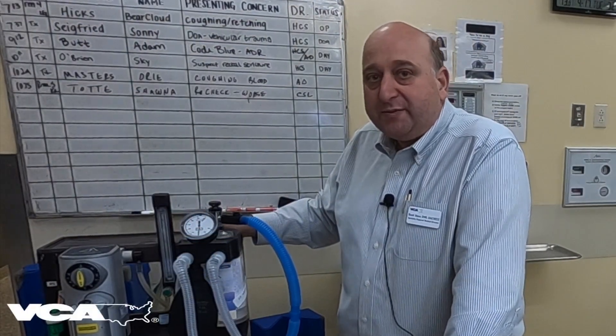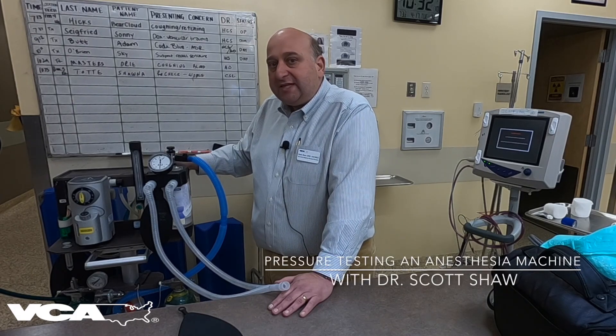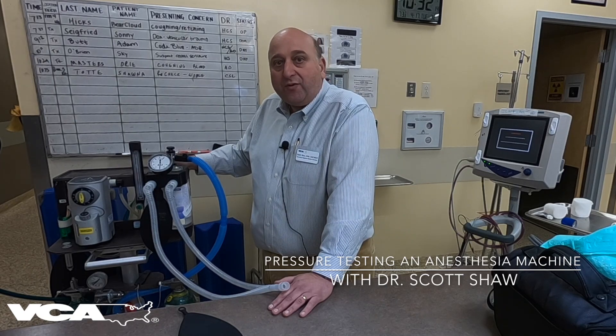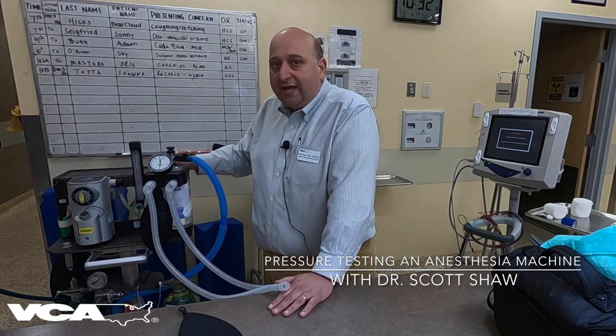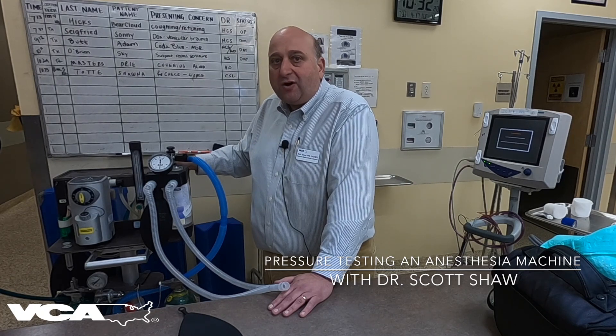I'm Dr. Scott Shaw and welcome to this week's Medical Minute. This week we're going to take just a moment and talk about pressure testing an anesthesia machine. The anesthesia machine should be pressure tested before every patient, not even just once a day. So it's a really important piece of our regular safety protocols to make sure our anesthesia machines are safe and functioning properly.